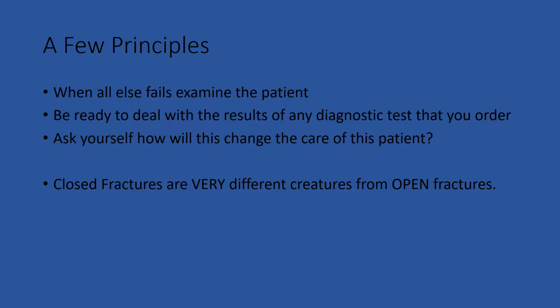So just a few principles before we start. X-ray or any kind of imaging cannot replace thorough history and examination of the patient. So I like to say, when all else fails, examine the patient. I've had a number of cases in which the imaging was unrevealing. But if you really went back and looked at the patient, took a good history, it really did become much easier to make the diagnosis. So always keep that in mind.